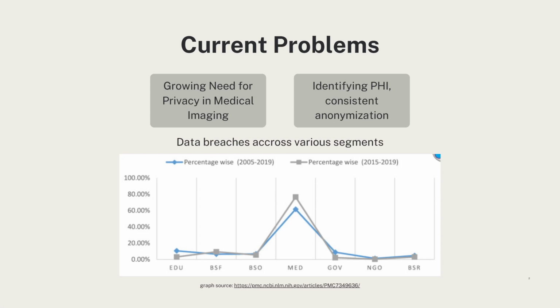However, removing patient information from a DICOM file is tricky, because personal details might not just be in the main data or metadata, but also hidden in other parts of the images like text or labels. The challenge is to find all the information, remove it consistently, and follow privacy rules carefully. This way, the files can still be useful for research or diagnosis, but without putting anyone's personal information at risk.